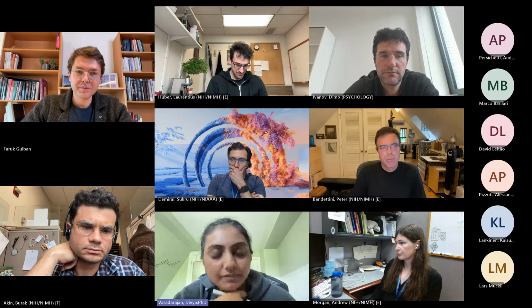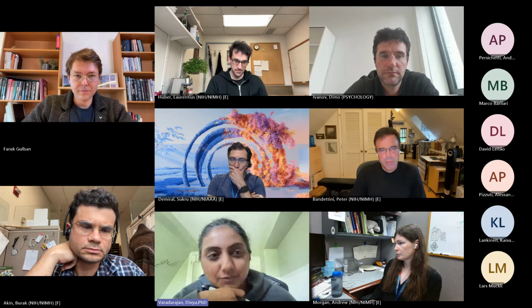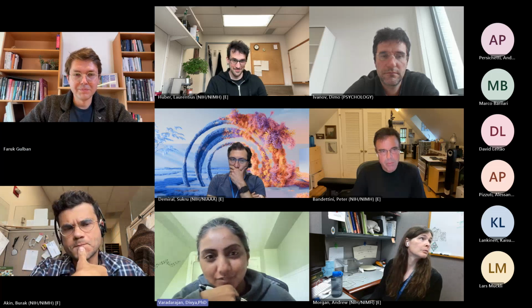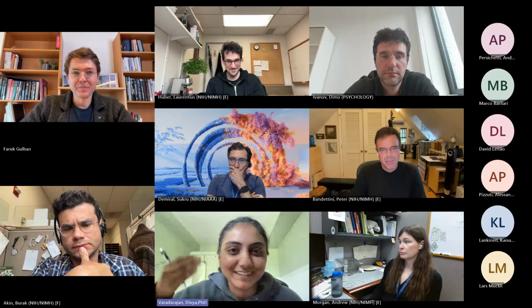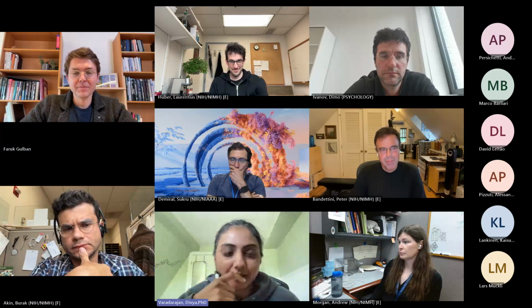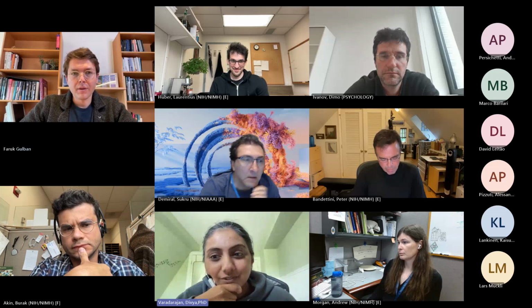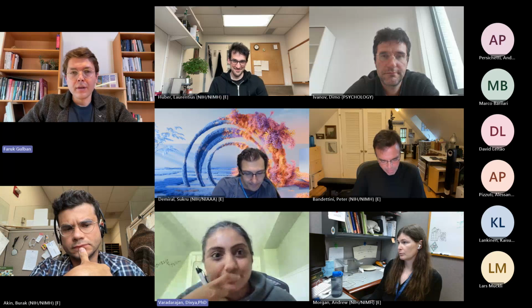Yeah, that's interesting, because then my next question to you is, when you generated those vein surface maps, I was blown away, because I have such a tough time getting cross-sections of these vessels in functional data, right? Because we are just acquiring a slice or slab. Do you see arteries? It seems to me like they should just have different T2 star, and you should see white dots along with your black dots there. Do you see them?